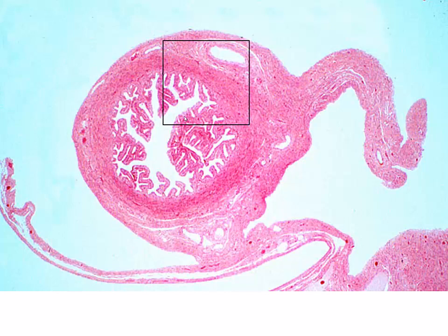So here we're moving into the deeper regions. This will be in the ampulla region. We can see the mucosa versus the muscularis. This would be the thickness of the mucosal layer, and there we have the muscularis layer surrounded by our serosal layer. Here we have some of the ligaments extending away.